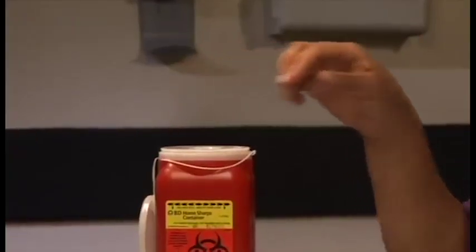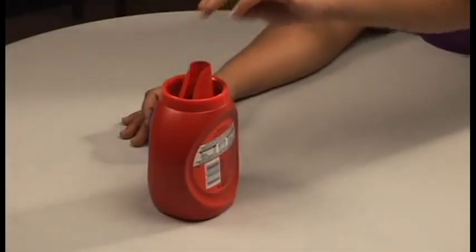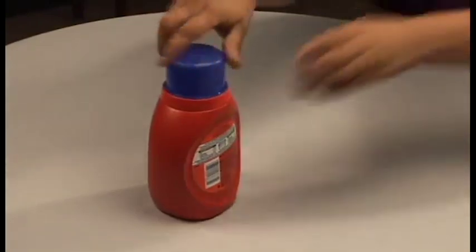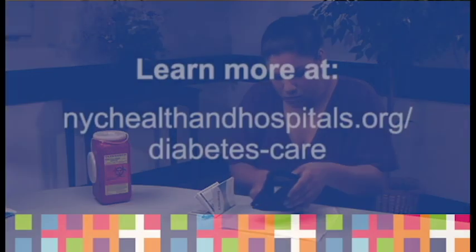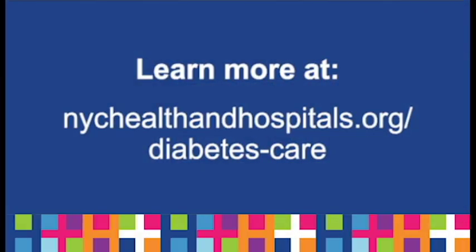If you don't have a sharps container, put the needle in an opaque plastic bottle and close it with a cap before throwing it away. Be sure to keep all syringes and medications out of reach of children. If you have any questions, contact your diabetes educator or your health care provider.